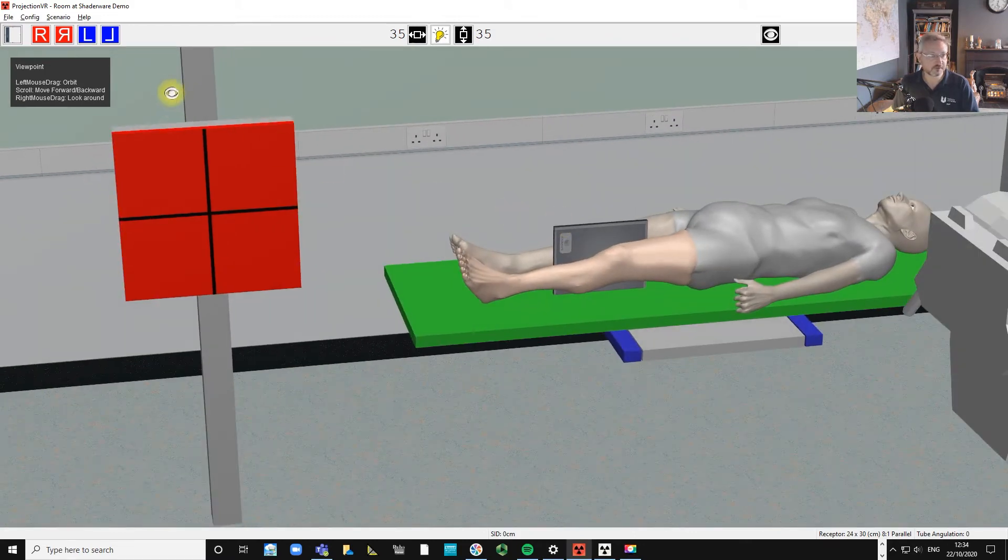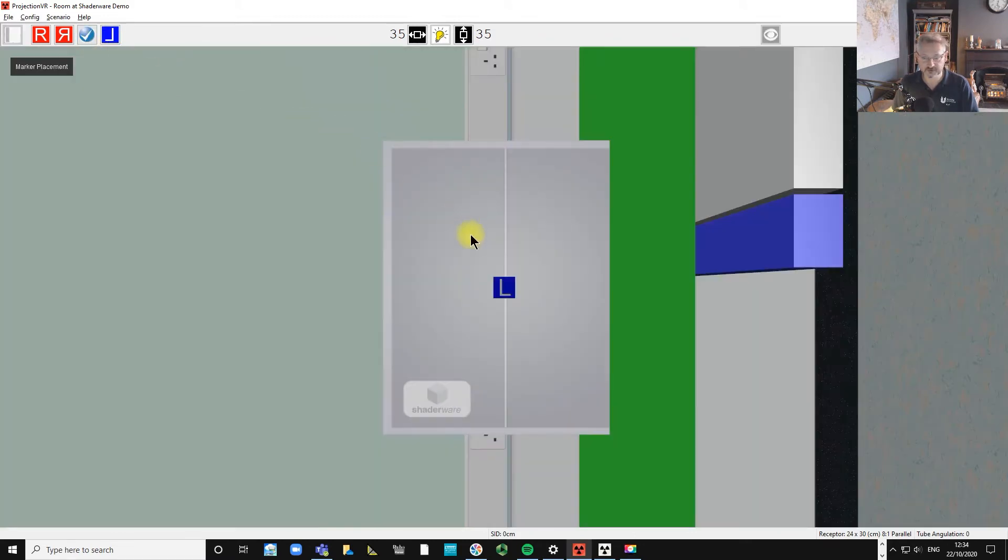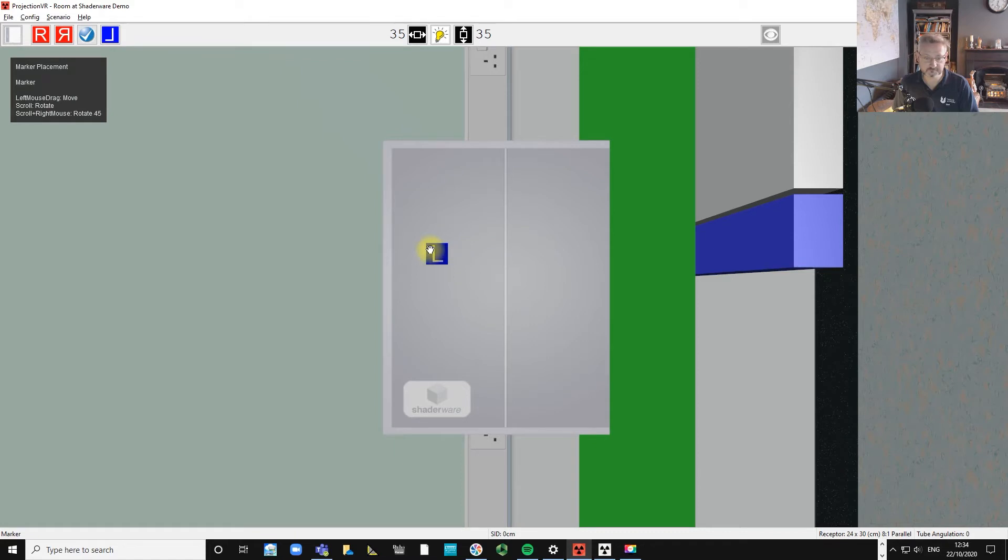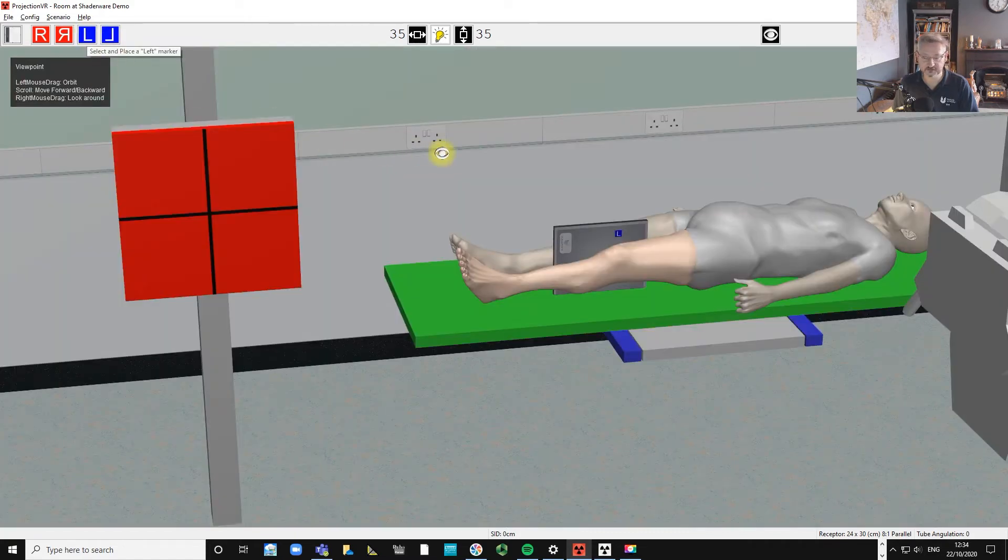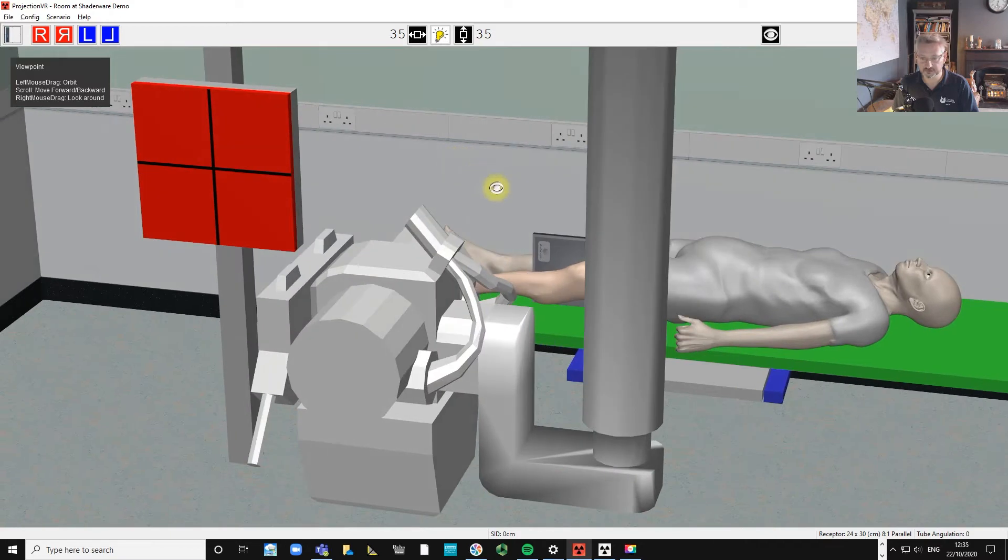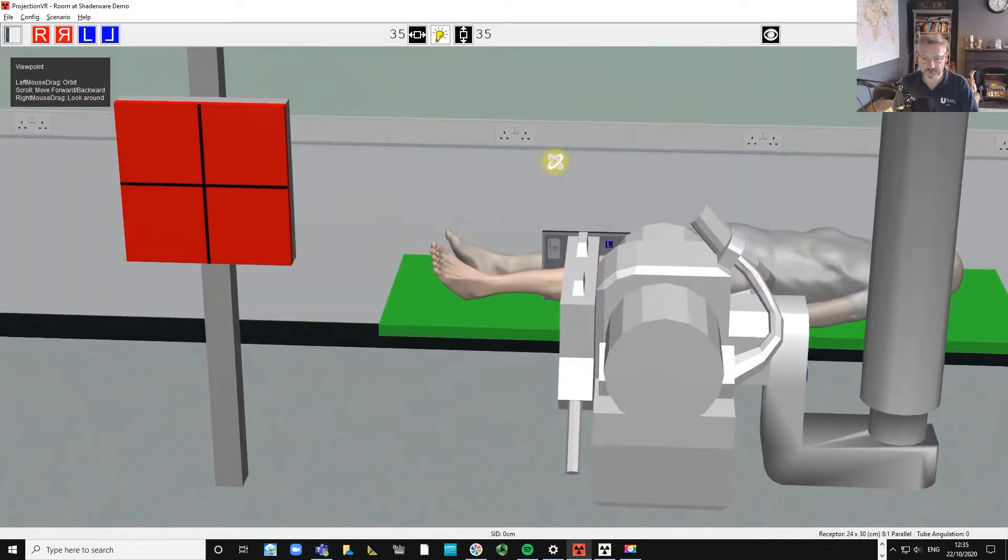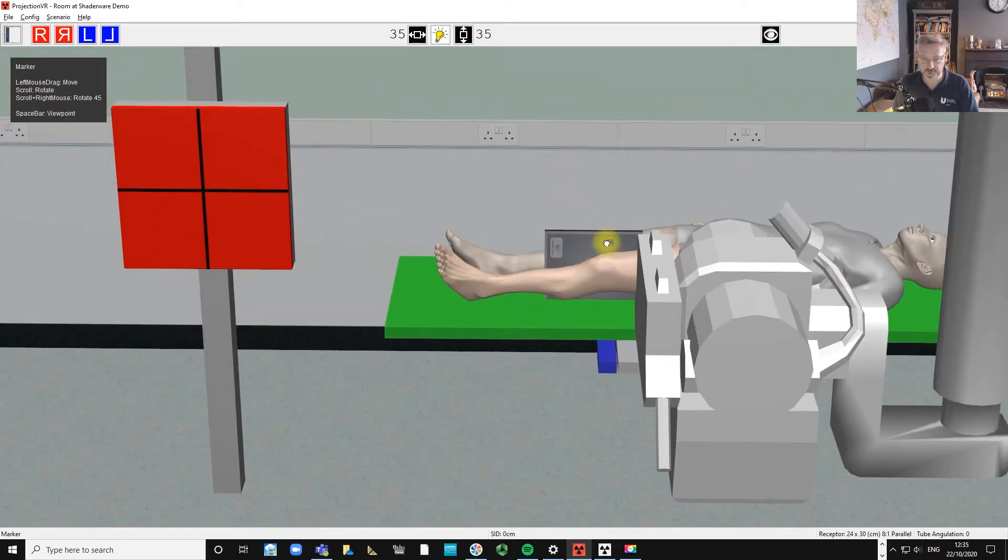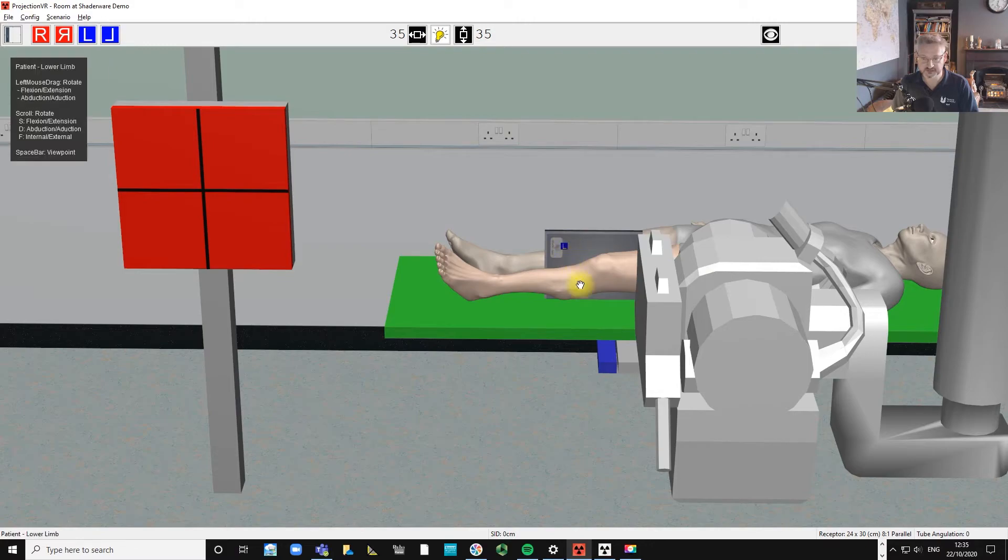Once we've got that positioned correctly, then we add our marker. And if you were doing this in the department, you'd probably add an arrow pointing up in the direction of gravity.